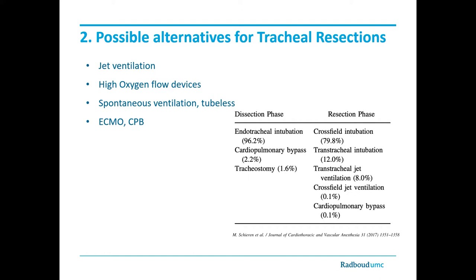In a systematic review of publications, almost 800 cases were analyzed. In the majority of these cases, cross-field intubation was used. In the last 10 years, the use of ECMO is increasingly reported. There were about 25 reported cases.